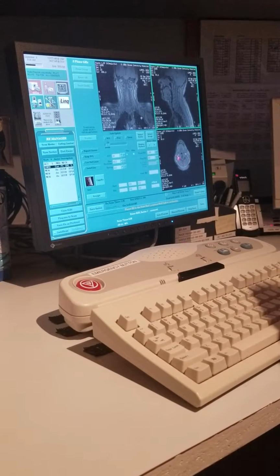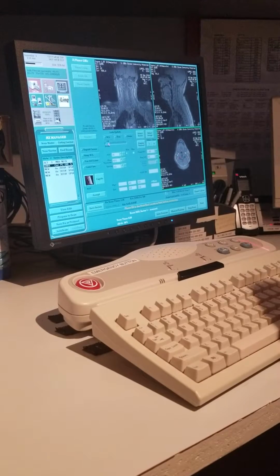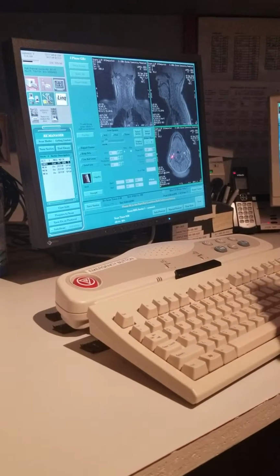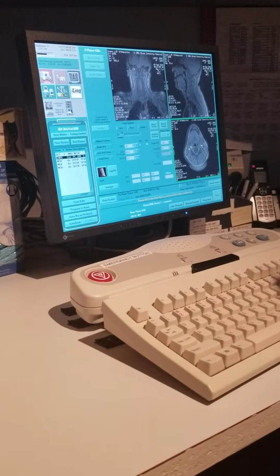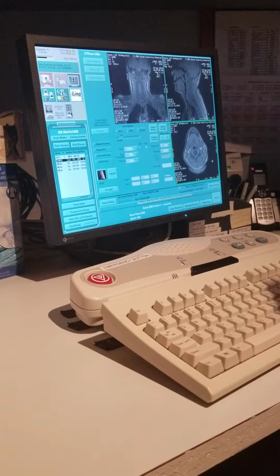Normally we'll do, see how we see them on this scout, gradient echo scout, our vessels are bright. That's what we want. So we see the external and internal carotid here. This may be the common carotid here. See how it's just one? There's the split, the bifurcation. So we're just going to shift click on one side or the other.